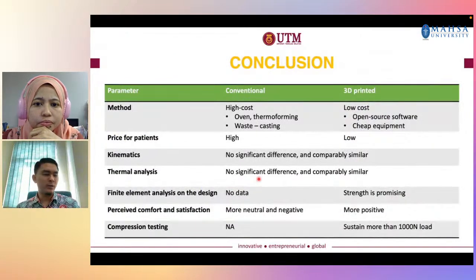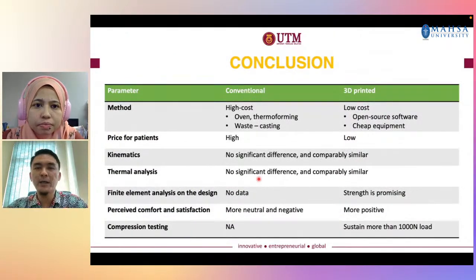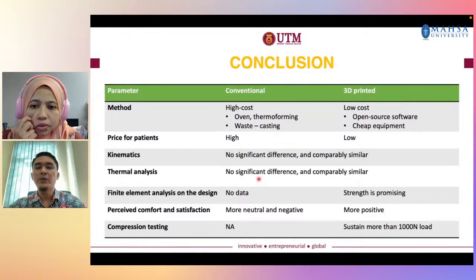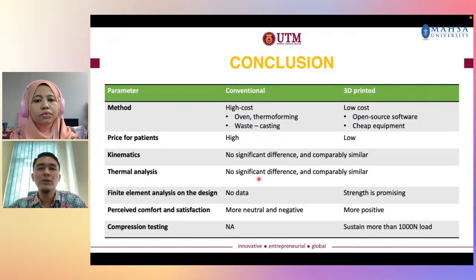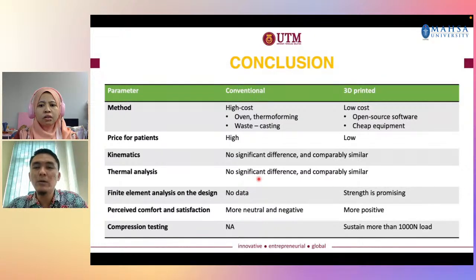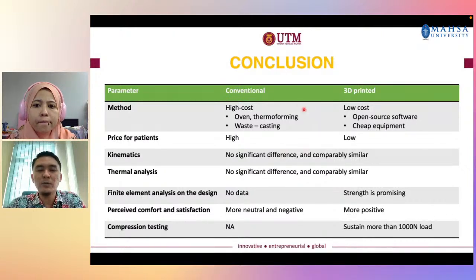So this is the conclusion for my sharing for today. If you compare between the conventional and 3D printed, of course, in the future there is a demand to conduct more studies to make sure that the data is sufficient to prove the 3D printed is very beneficial, and also maybe can replace the old conventional method. And then this is what I can conclude between the conventional and 3D printed.